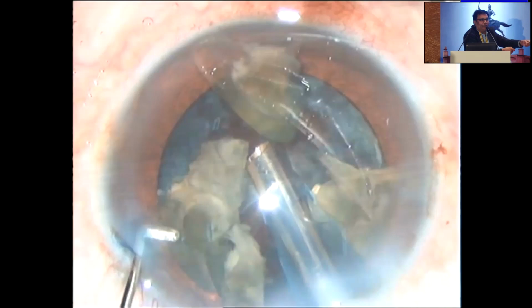If your phaco tip is in the periphery, phaco fluidics will be less. If it comes to the center, it will be better. And then if you keep your phaco tip here, the current will assist the flow rate and vacuum, and your phacodynamics will be better. I already mentioned this is not an advancement. This you observe and understand after 10 to 15 years of practice.